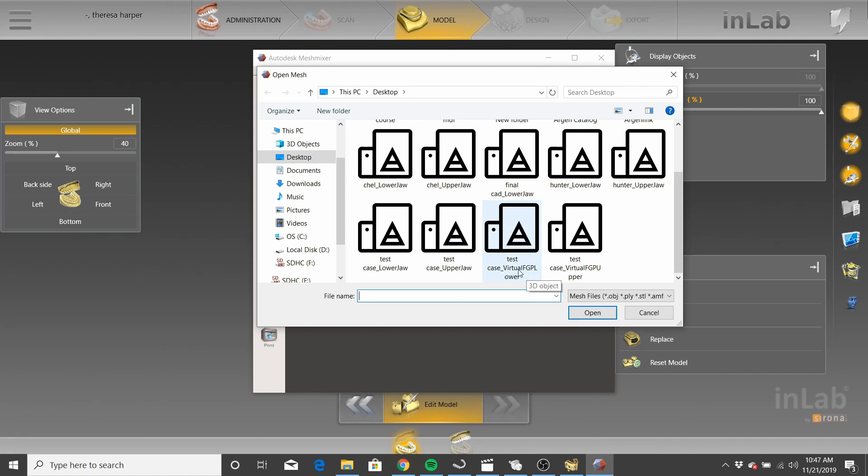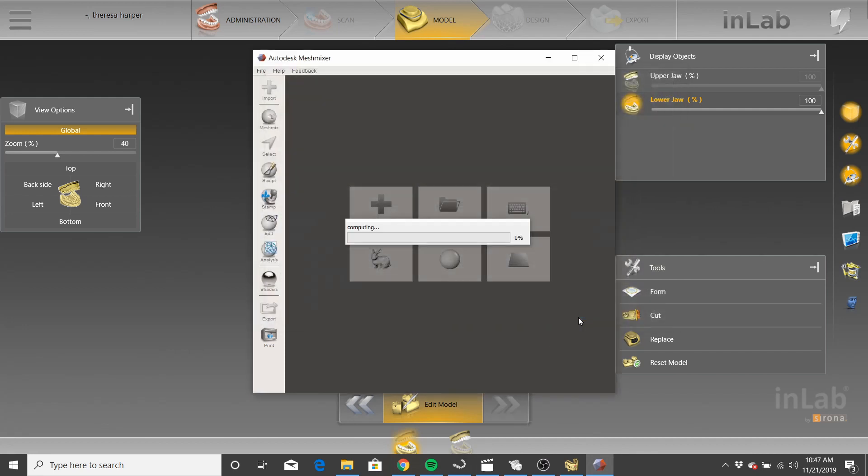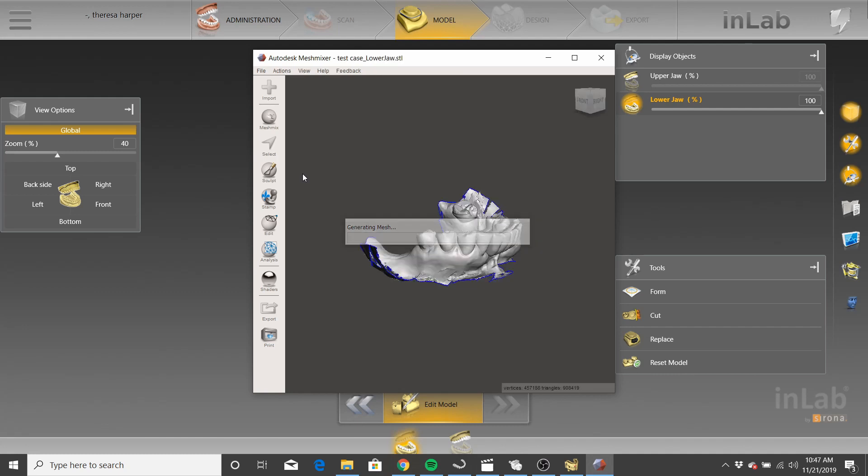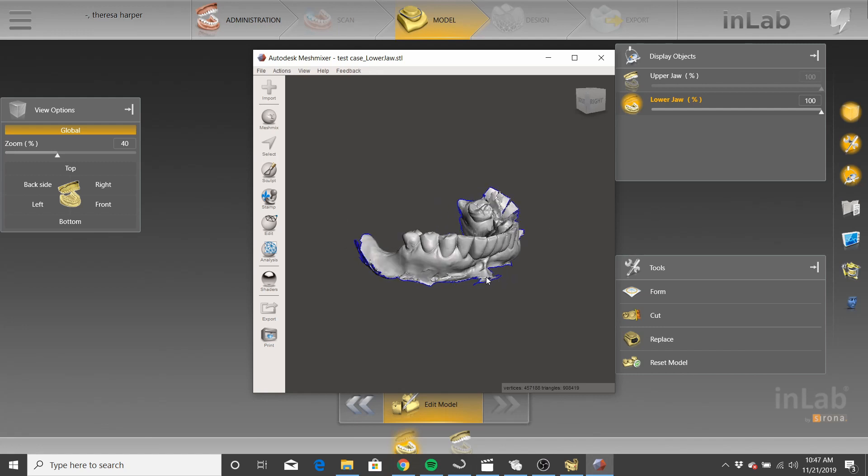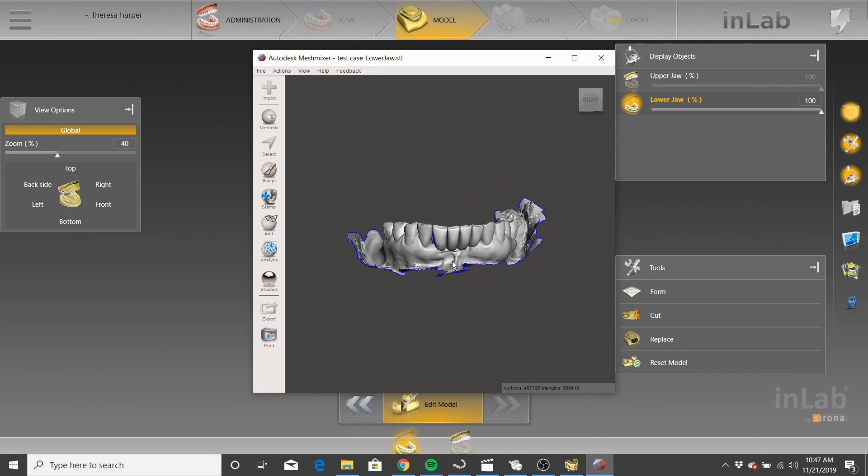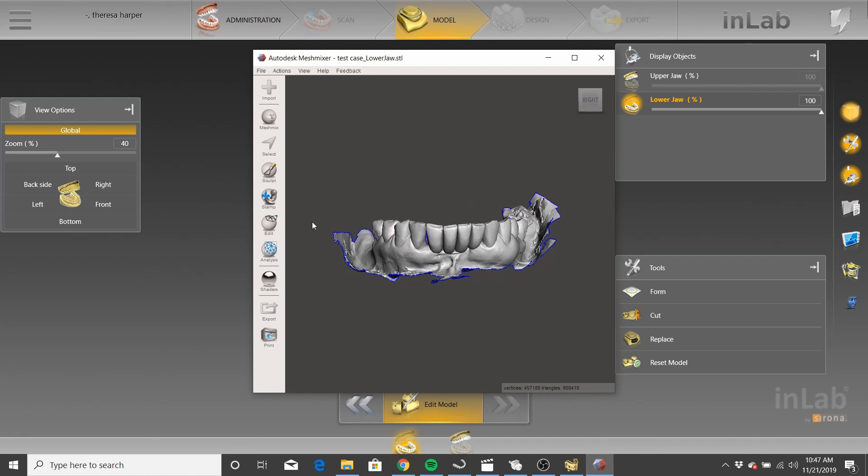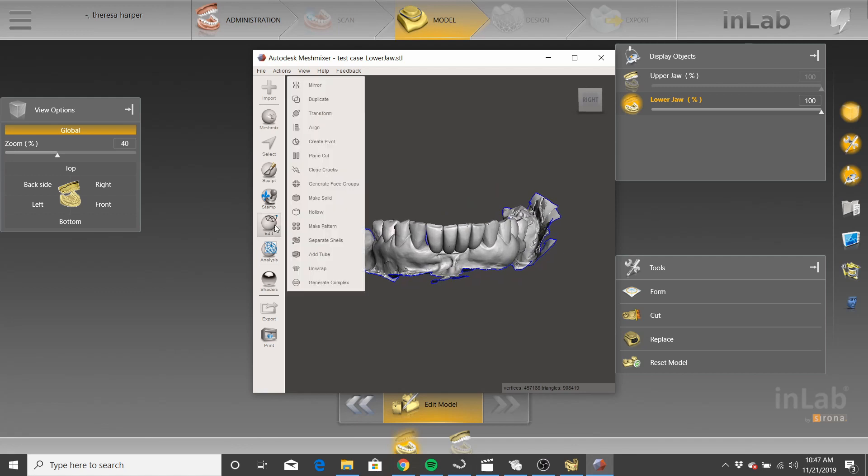Disregard these. These were part of the files for the virtual articulation. So we're going to go to the lower jaw because it was our lower jaw. Open. Generating a mesh. We've got our mesh. Now, I'm going to show you what's happening here. When you go to edit, go to separate shells.